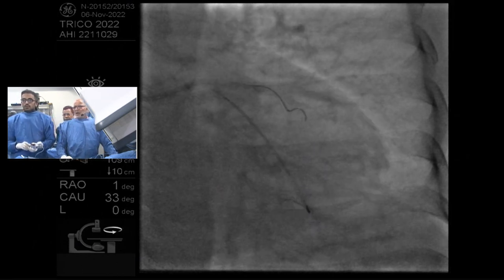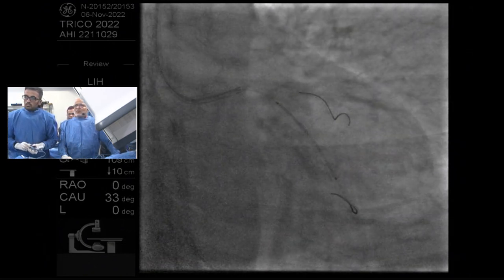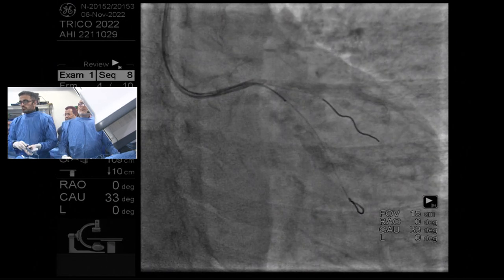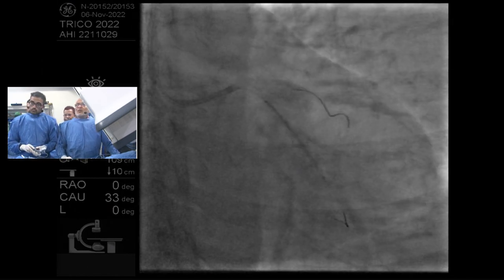Did we move the table? The key is to not move the table. So, don't move the table, please. Just for the audience so that they understand the procedure. No, that's fine. We haven't moved the camera. We're good. So there, and just fluoro. There. You're right there.